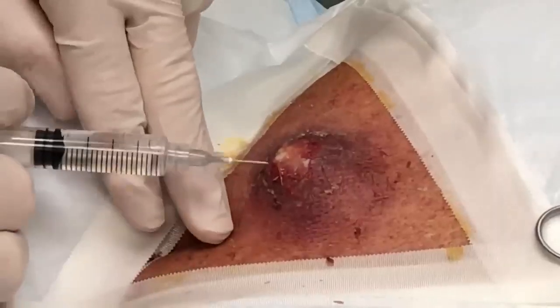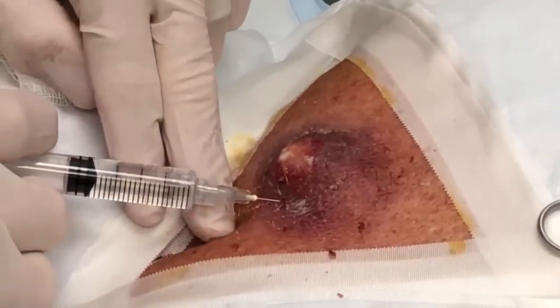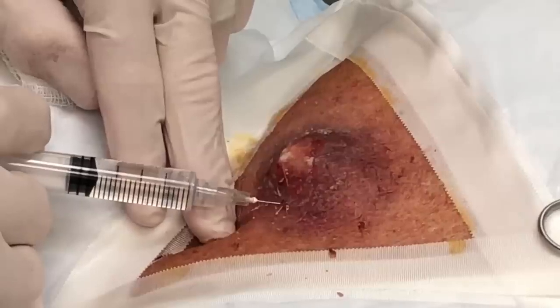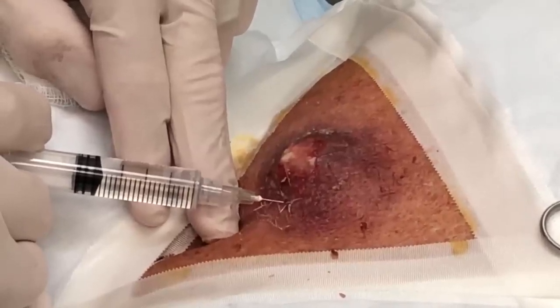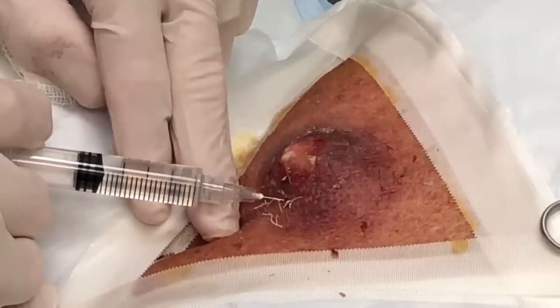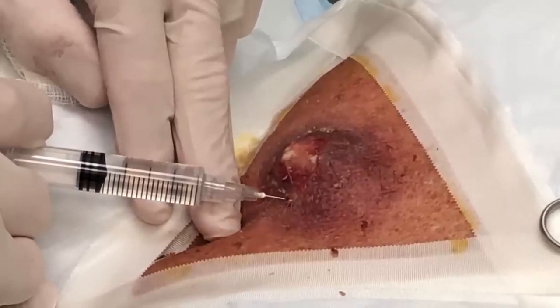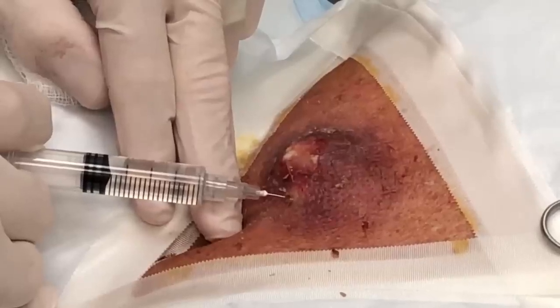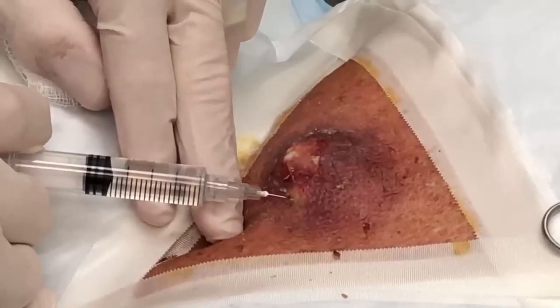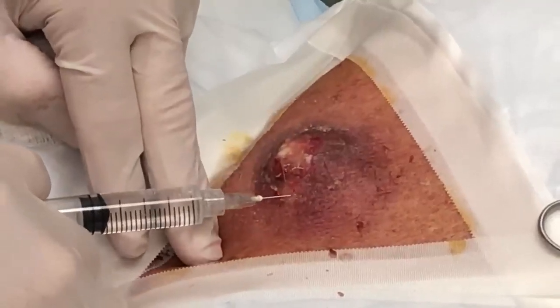Right. So Gummy Gene's going to spray a little cold spray, and I'm going to numb this up with a little lidocaine with epinephrine. You're going to feel a little stick, sting, and a burn. And my objective now is to not inject fluid to the point where this erupts all over the place. Gummy Gene, you froze my needle. That's okay. It's working now. So the medicine's going in slowly. That sting much? A little bit.